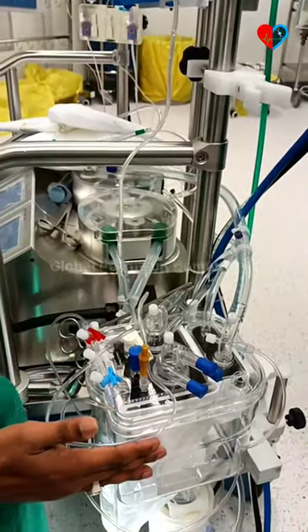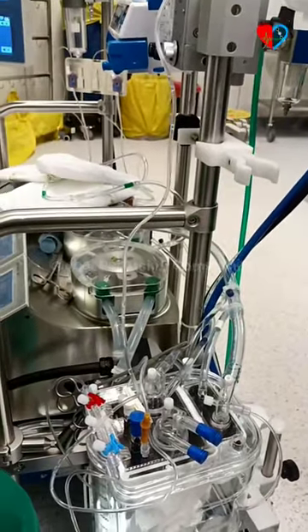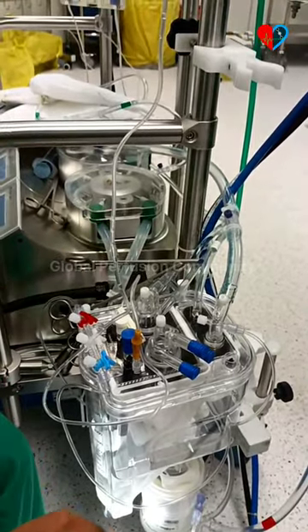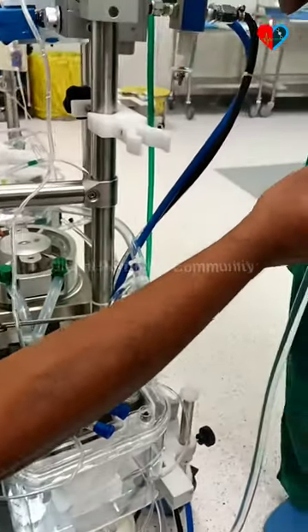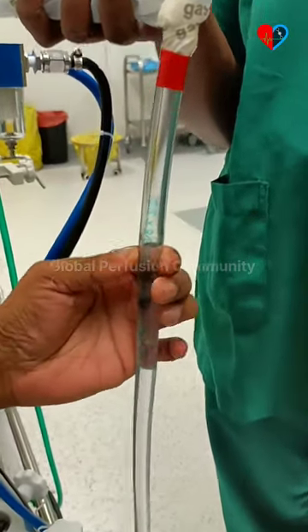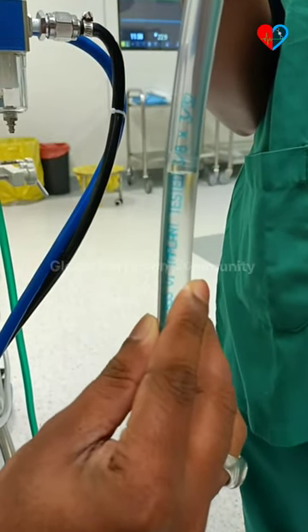We have finished the entire priming of the circuit. Now we have to go for the occlusion. First we have to make sure all the recirculation lines and shunts are clamped. Everything is clamped now, and we are seeing the fall of the fluid here — there is no fall right now.